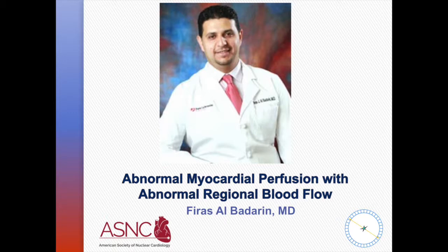Now, with the multiparametric input from PET, we are in a better position to provide more granular interpretation, not only about the presence or absence of obstructive disease, but also about the extent of the obstructive disease, and also about the integrity of the coronary circulation from the epicardial arteries down to the microcirculation, and translate that into prognostic information that informs patient management subsequently.